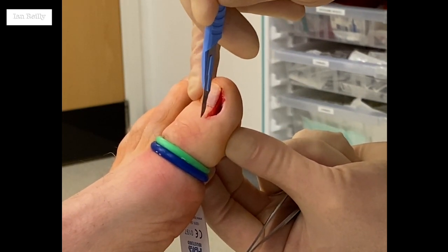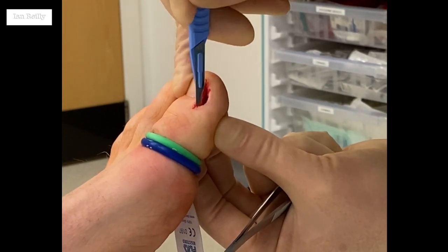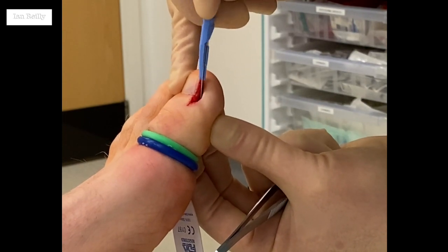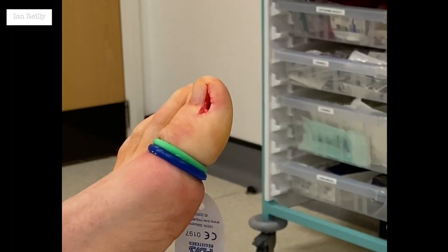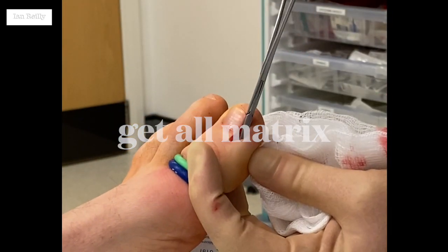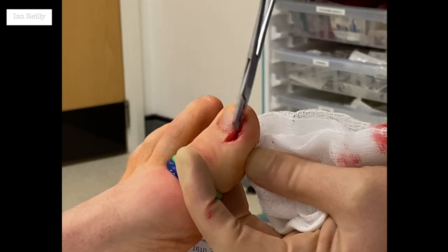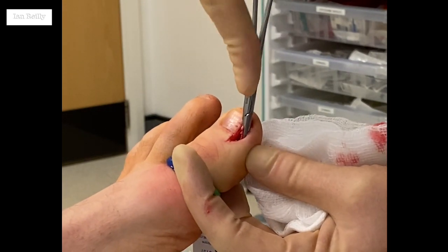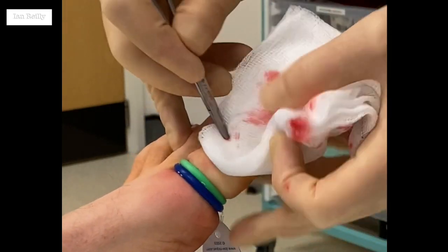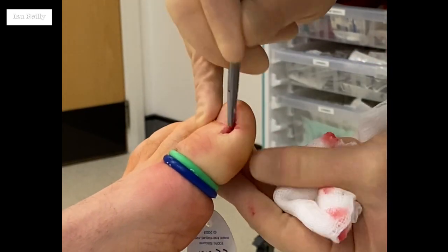You want to make sure all of that is out — this is the bit where you miss — coming back a little bit proximally and in this case mesially, to make sure you get all of that root out. Just a little bit suspicious of a bit of nail root — better out than in. There she blows. It's just worth taking a little bit of a minute to get all this nail root out. Now it's a little bit more aggressive than that phenol technique you had ten years ago, so it does tend to be a little bit more sore, so you probably need to take a few more in terms of painkillers.